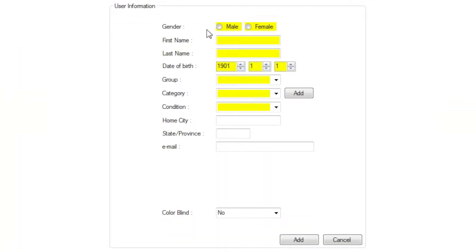Fill in your user's information. The fields highlighted in yellow are required. Everything else is optional. Fill in gender, first name, last name, and date of birth.